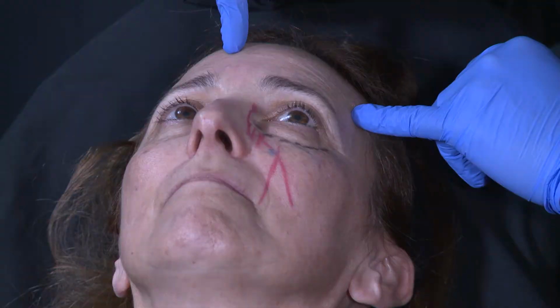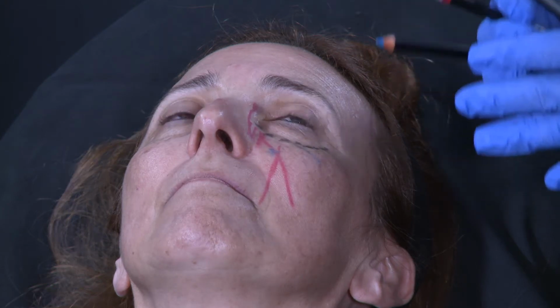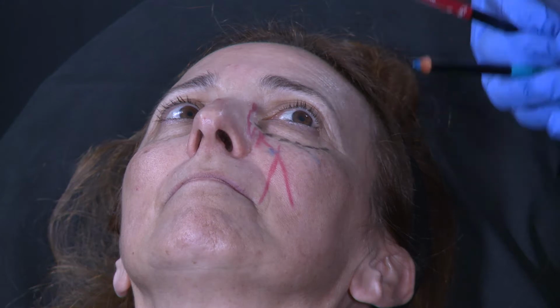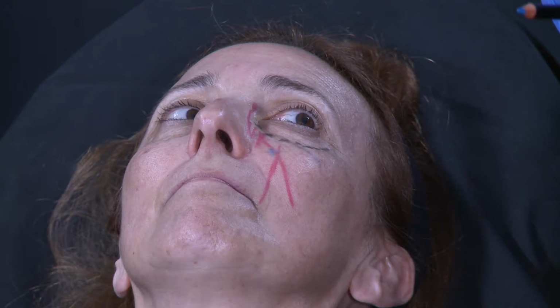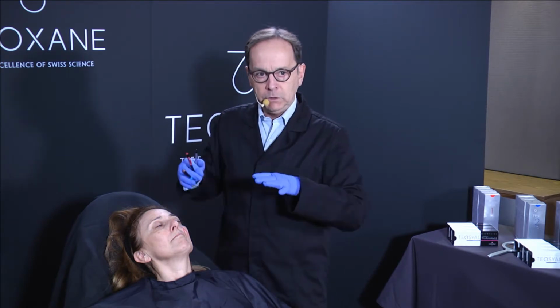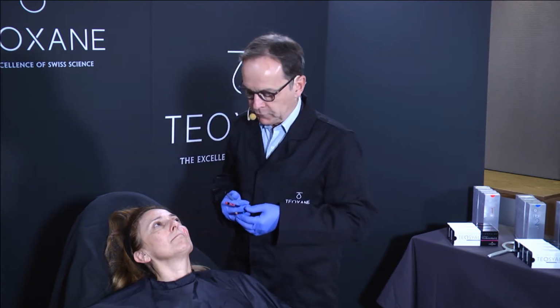A point of technique: do you know what is the best level to inject your patient? It's what we do in surgery. The best level to inject is the level of your elbow. It means that your injection site needs to be where your elbow is. So you need to go up or down with your table to put your patient in the right position.